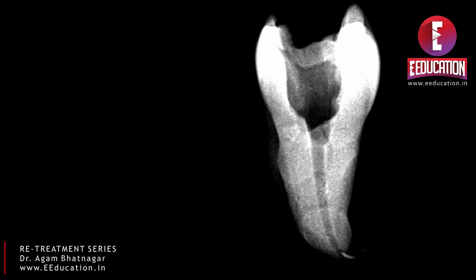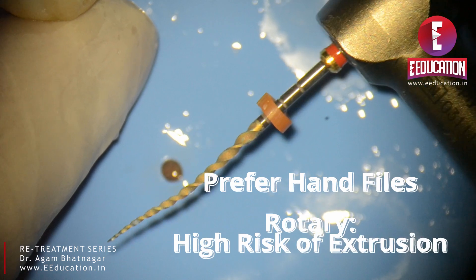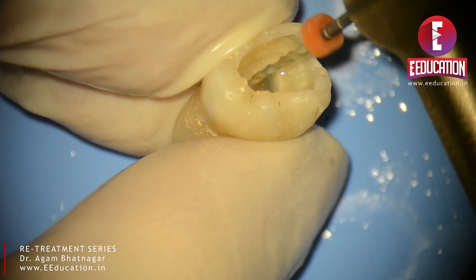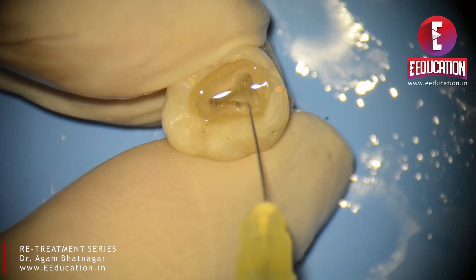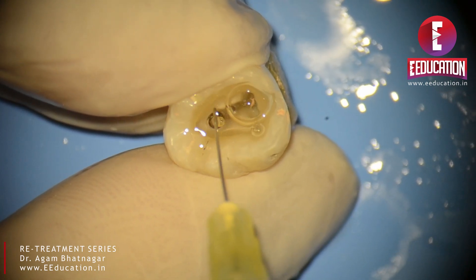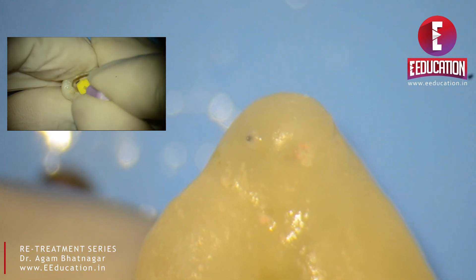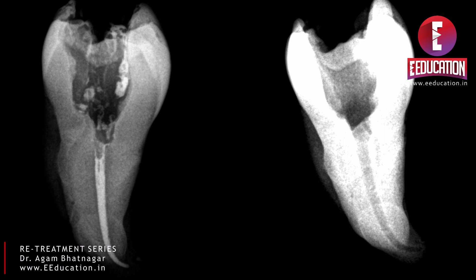Looking at the IOPA, we are only left with gutta percha at the extreme end of the apical third — that is tricky gutta percha. Inadvertent or wrong use of files can push it further forward. Here we use an EDM 25 after creating the necessary path with a hand file. The idea is to prepare the apical third and in the process also remove the remnants of gutta percha present; when we irrigate, that gutta percha comes out in flakes. Using careful hand instrumentation, we establish apical patency and preserve the original canal anatomy, removing all gutta percha from this tooth.